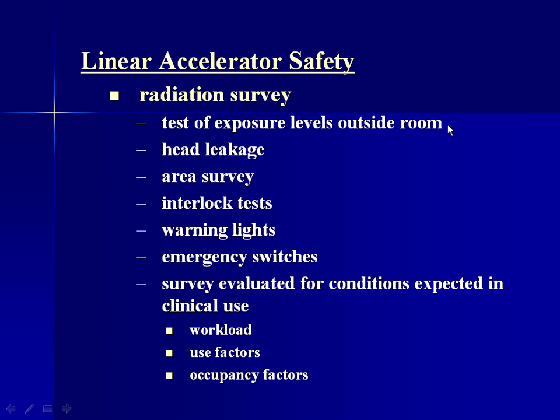There are a number of safety tests that we do. This is done when a machine is brought in, and we do it on an annual basis. We're making sure that the exposure levels are safe outside the room. After all, the therapists are there all day, whereas we're just in and out. So it matters less to us, but it matters a lot to them.